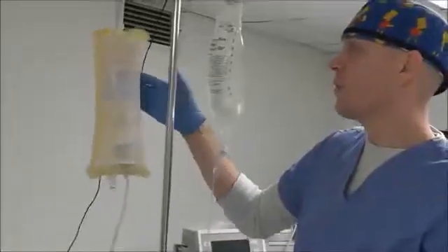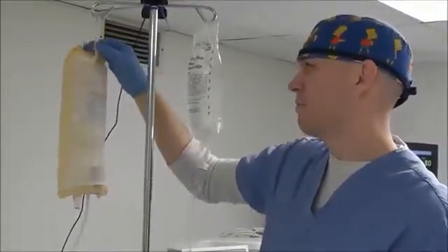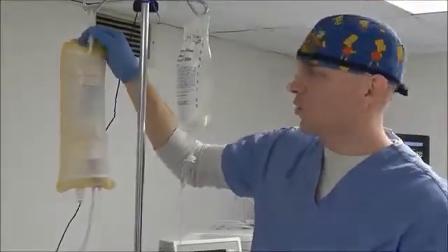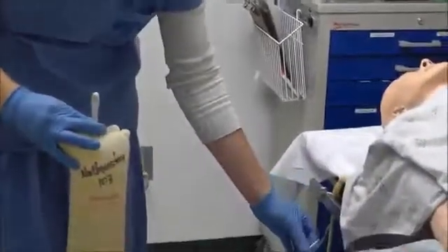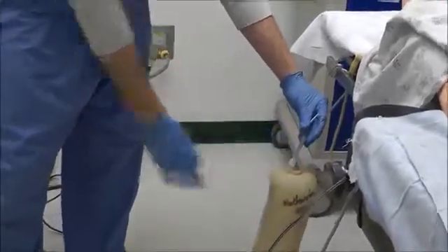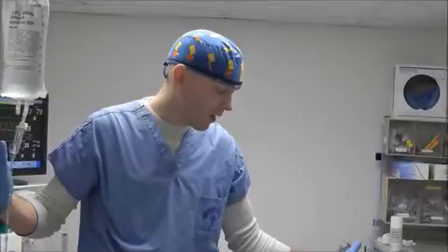Sometimes you have multiple IV bags hanging, and adding another pressurized saline bag just adds another bag that you're hanging. This actually doesn't need to be hanging on an IV pole, so what I do is I grab an endotracheal tube stylet and hang it off the side of the bed, and I just hang this pressurized bag down there. And that allows it to stay out of the way of all of your other bags. And once you do these steps, your A-line is set up and you're ready to go.